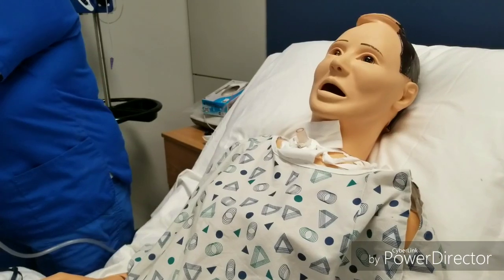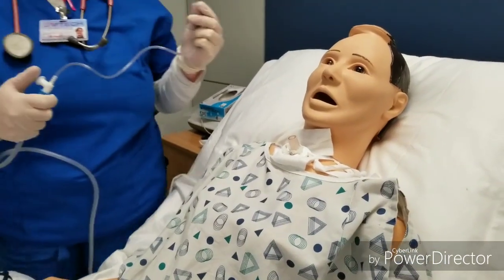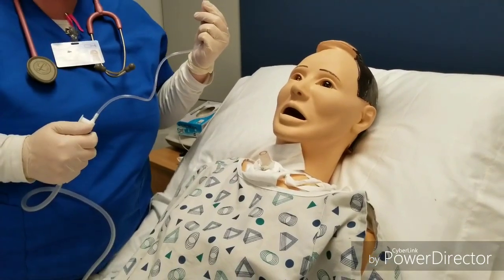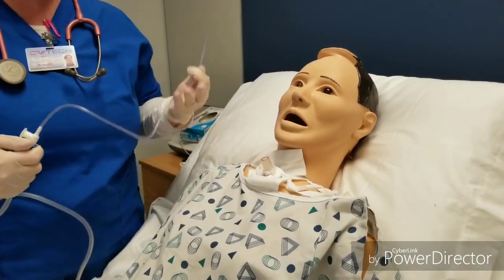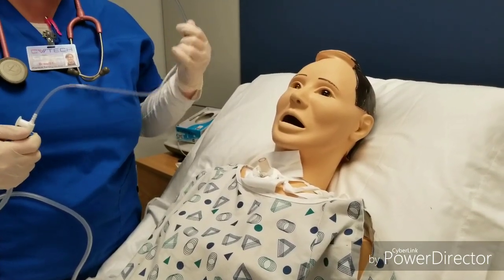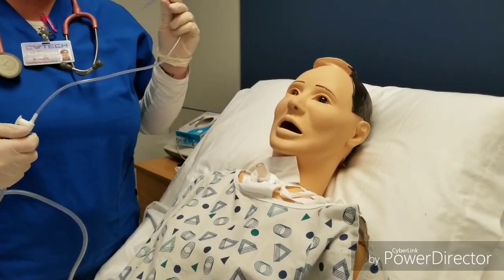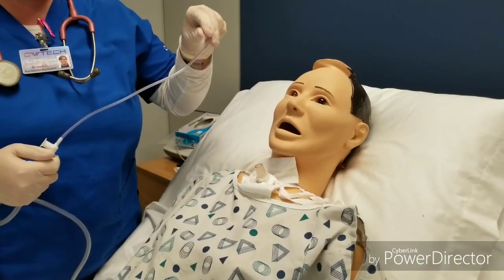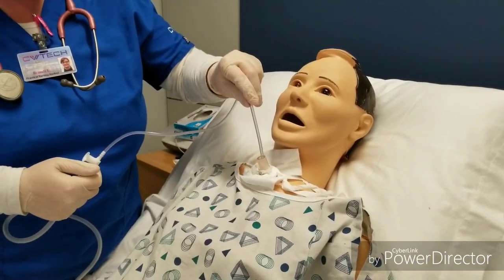Clear your tubing. Assess your patient. Oxygen, good. And if they need it again, go ahead and do it again. But be sure and give them a break in between each suction. For the purpose of this video, I'm going to go ahead and do it again so you can see how you move the tubing and stuff.